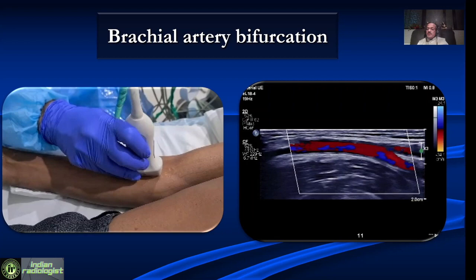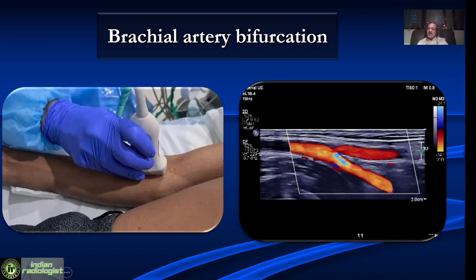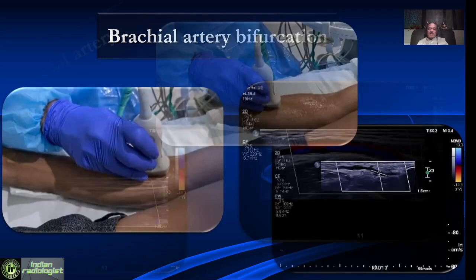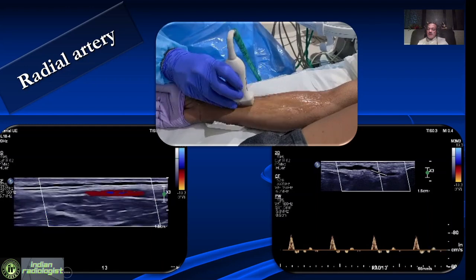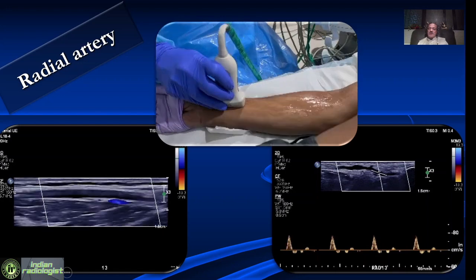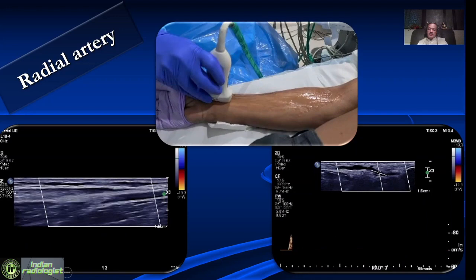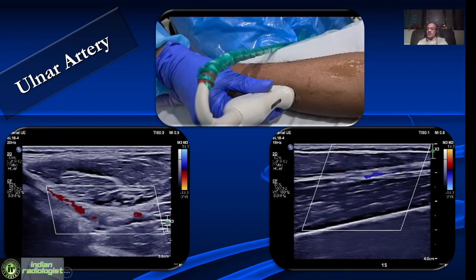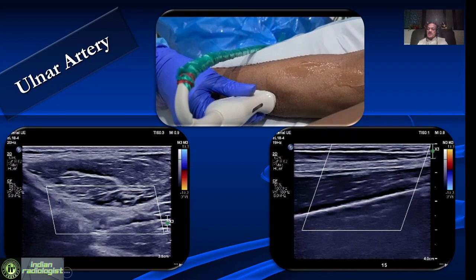It is very important to look at the brachial artery bifurcation — the radial artery going superficially and the ulnar artery going down. We then trace the entire radial artery right from its origin; it is easy to evaluate because it is superficial. As you go distally, we see a high resistance waveform, especially in elderly patients. Then we look at the ulnar artery — its mid portion is often difficult to see as it dips down at origin, but once you come closer to the wrist, the ulnar artery becomes superficial and easy to evaluate.